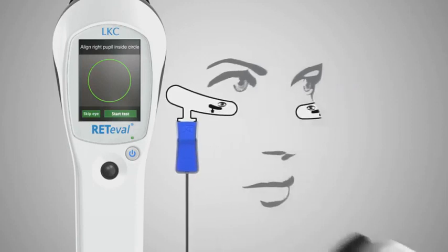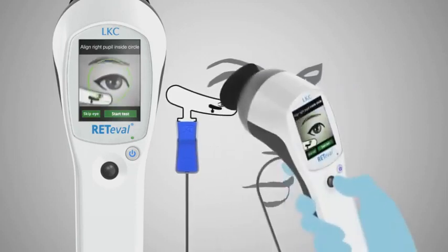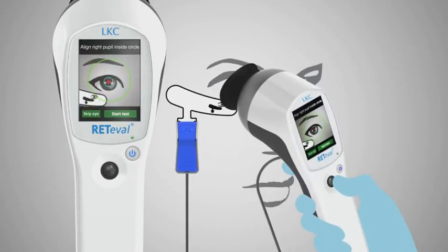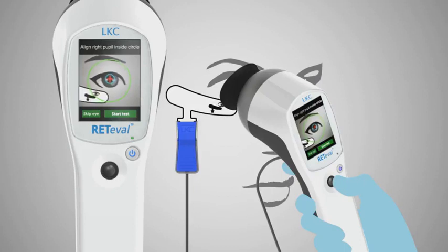Position the device over the patient's eye under which the sensor strip is connected. Ask the patient to look at the red fixation LED and using the live video provided by RETeval as a guide, position the pupil of the eye within the green circle shown on the display.